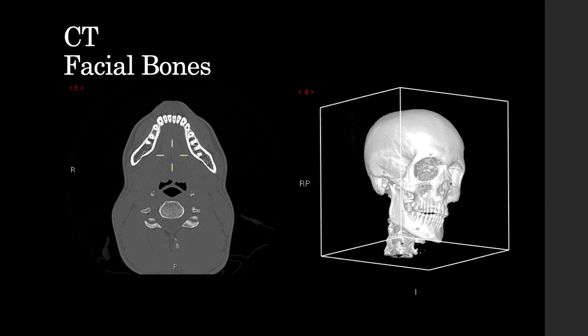Conventional CT, single slice and multi-slice detector CTs, are very good for this. However, a lot of focus has moved recently to cone beam CT, and a lot of people ask me what is cone beam CT and how does it work, because it does seem like magic, and I've got to admit it is kind of like magic.